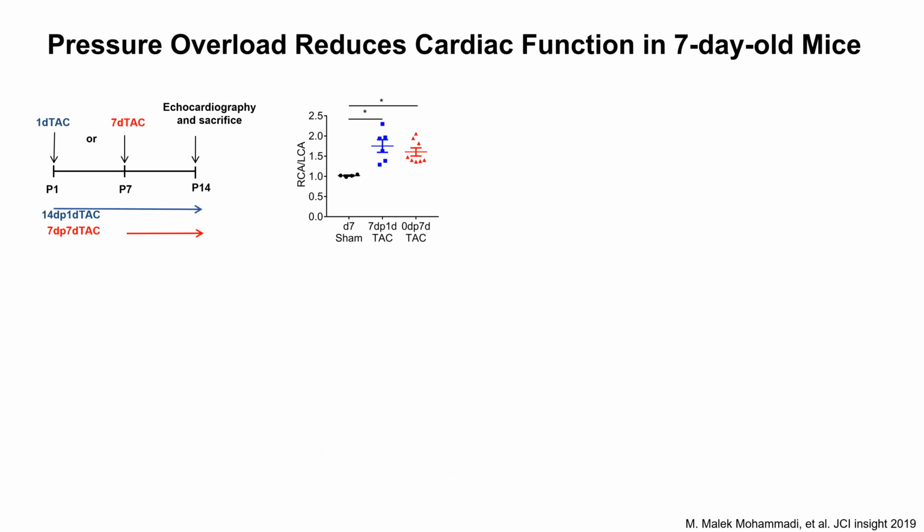But my aim was to compare whether there is a difference in the regeneration and non-regeneration phase. That is why I continued the surgery from the first day till the 14th day. And I also compared it with surgery starting from the non-regeneration phase, day 7, until day 14.